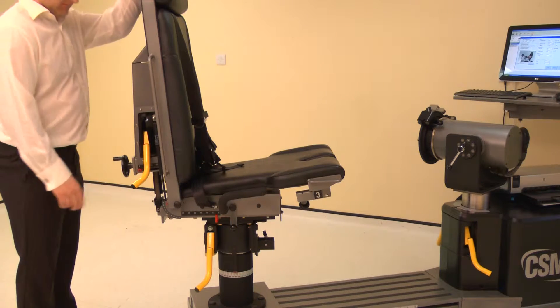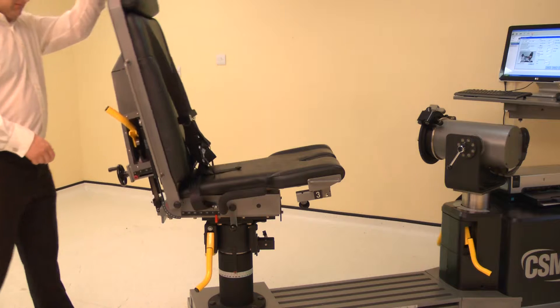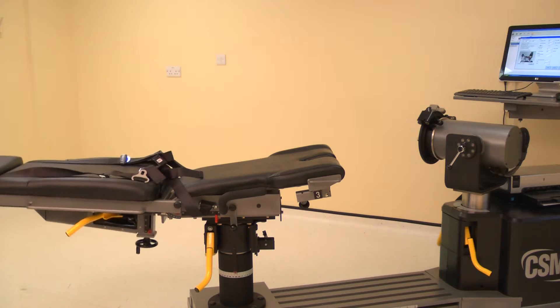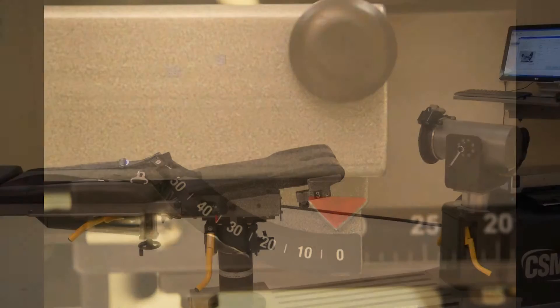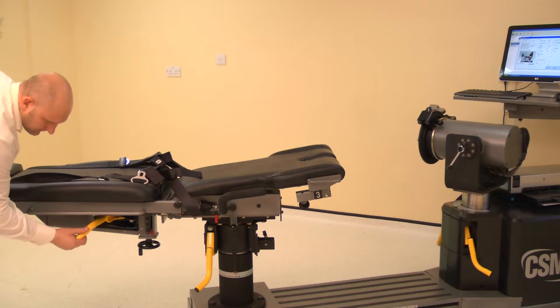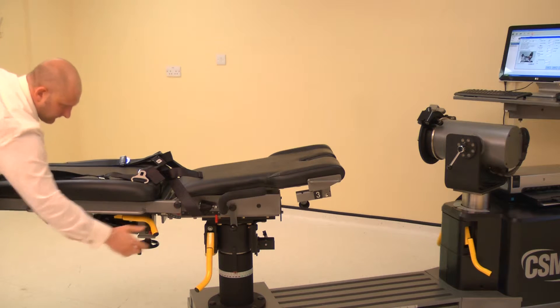To set the chair back angle, lift the locking handle and adjust the chair back. Adjust the chair back angle to 0 degrees. Lock by tightening the handle.